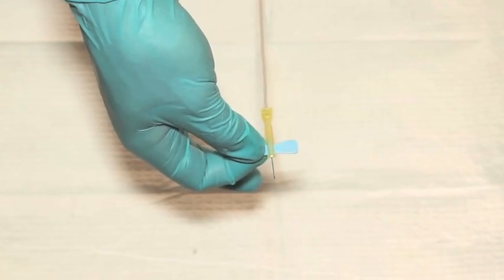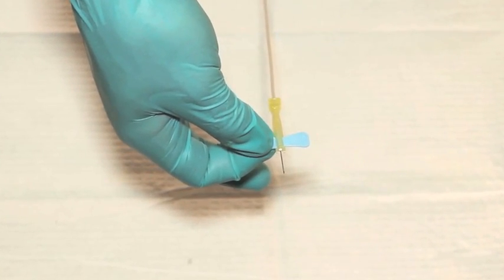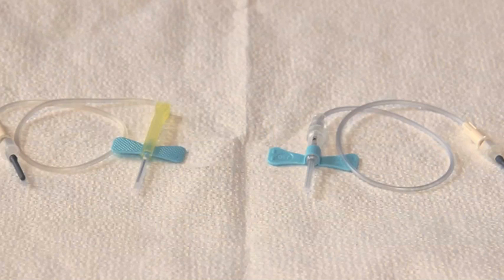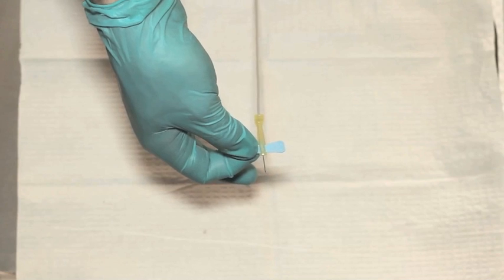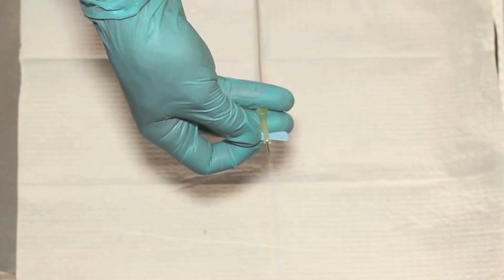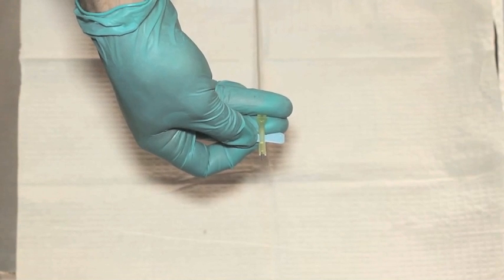Our method requires the use of a butterfly needle since it eliminates the need to activate the safety mechanism. However, be aware of two different needle types, sheath needles and spring retraction needles. If the safety mechanism is a needle sheath that slides over the needle, place your third and fourth fingers under the sheath and push up from its base, closing it as shown.